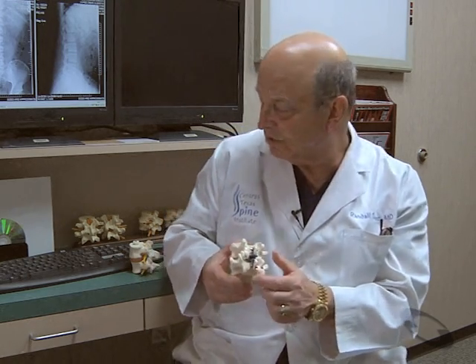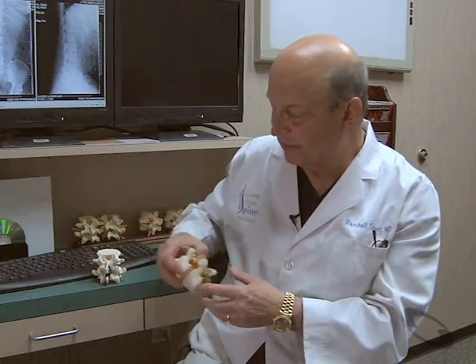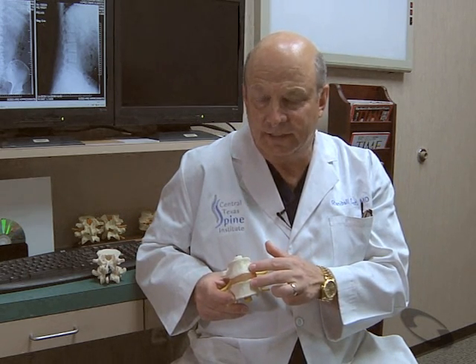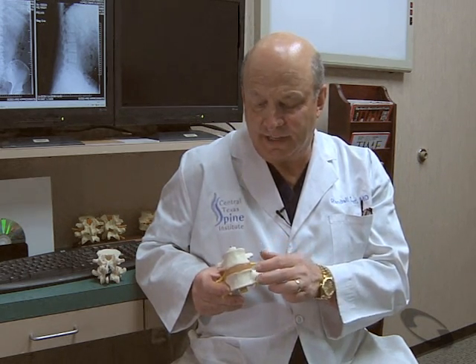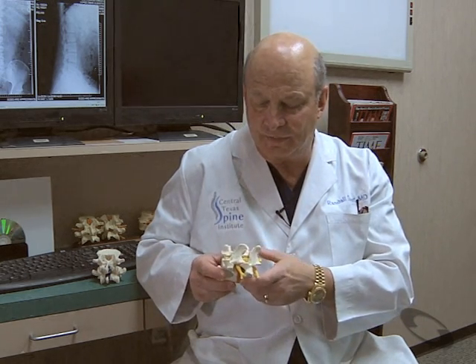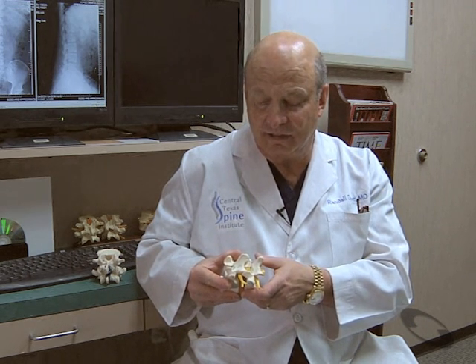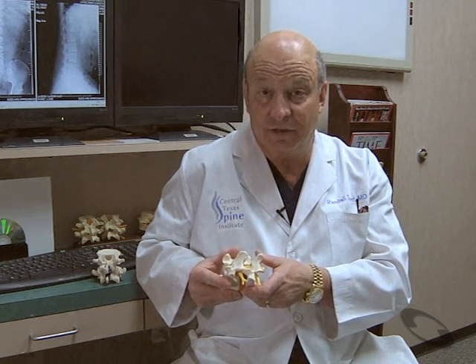In my experience, what happens is with interbody cages, we can feel like we have excellent fixation with intervertebral screws, an anterior plate, all kinds of different ways of locking this together. But if you then turn the patient into the prone position to do a decompression, you'll see that there's still significant micromotion of the facet joints.